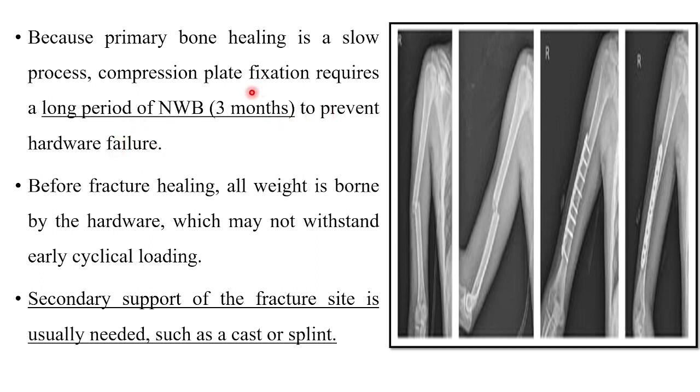So as I already told, with stress shielding devices the healing occurs through a primary pattern, and it requires a larger healing period compared with your secondary healing. That means it takes more time compared with secondary bone healing. That is mainly with your stress shielding devices.